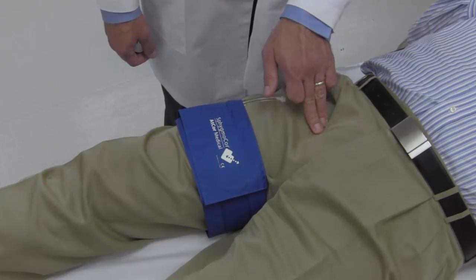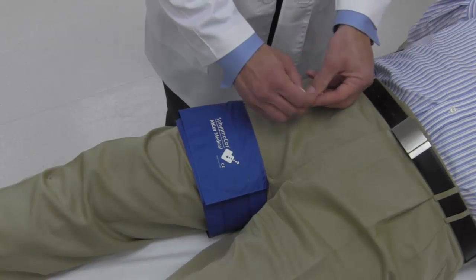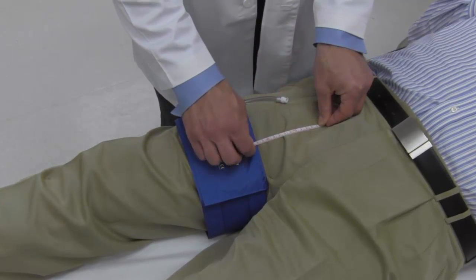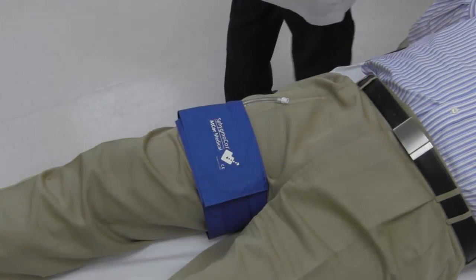Enter this distance into the femoral to cuff field. Note that it may be difficult to palpate a patient's femoral pulse through clothing, in which case it may be necessary to palpate directly on the skin.